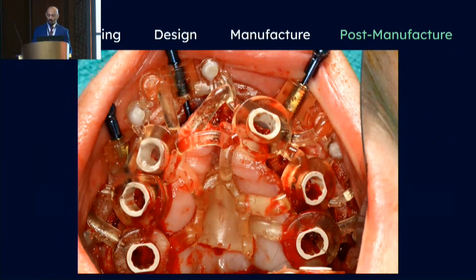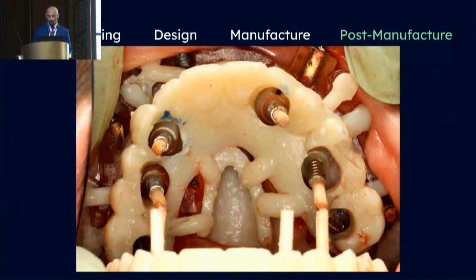The use of the magnets in this case helped in retention of the implant guide hands-free, providing an easy approach to implant placement. The immediate load prosthesis was then stacked in a similar fashion and temporary cylinders picked up via polymethyl methacrylate resin. Thankfully, immediate loading was possible on 4 out of the 6 planned implants, and the remaining 2 posterior implants were left to heal for conventional loading in the definitive hybrid, as they had some lack of initial torque.